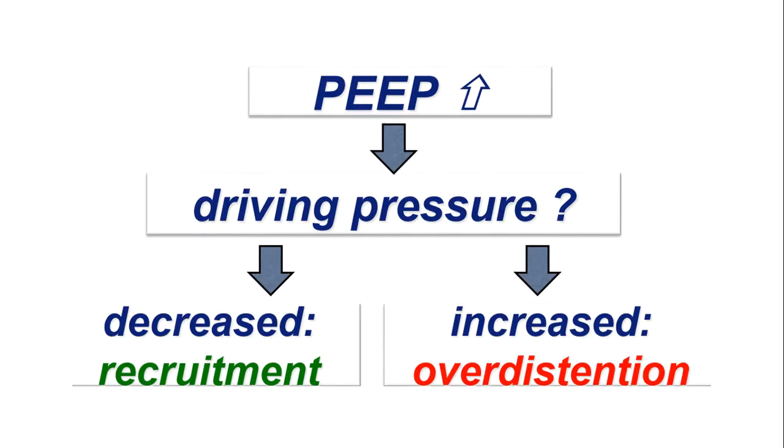This overdistension concept is very important because this is something which we neglect. Overdistension leads to decreased venous return, increased strain on the right heart, leads to zone 1 phenomena, leads to further worsening of hypoxia, further worsening of hemodynamics, and the entire vicious cycle. The patients who are borderline will have acute cor pulmonale, and then that can be a disastrous condition for you to ventilate.